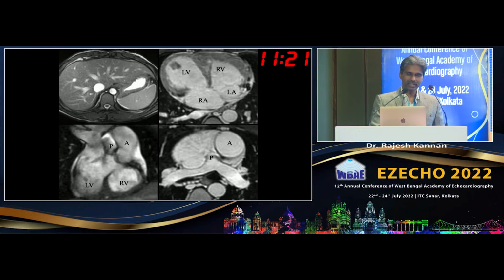I'll just complete by showing one complex case where cardiac MRI gives you an overview of different morphology and the functional information.